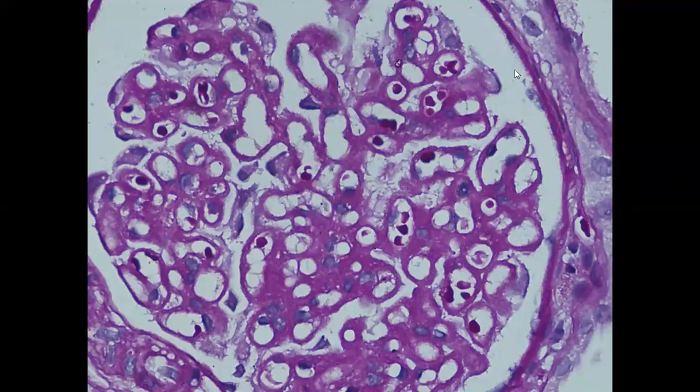Very good. What else? So there is thickening of the glomerular capillary wall for sure. There is minimal mesangial expansion, but there is no mesangial hypercellularity, because when I say mesangial hypercellularity, there has to be more than four nuclei. Here you can see one nucleus. You don't see any significant mesangial hypercellularity.